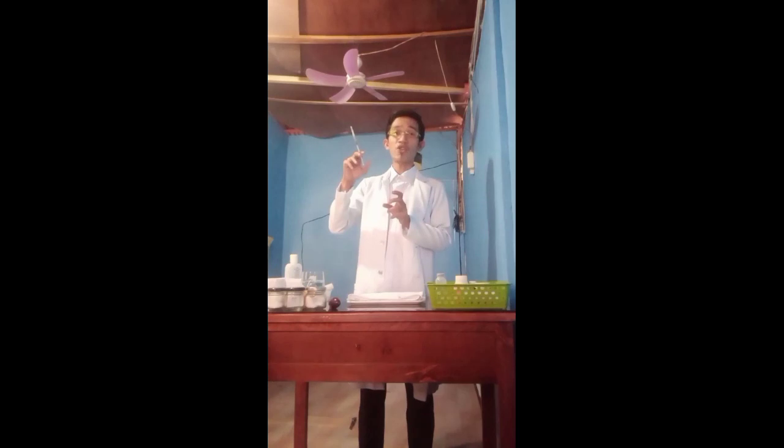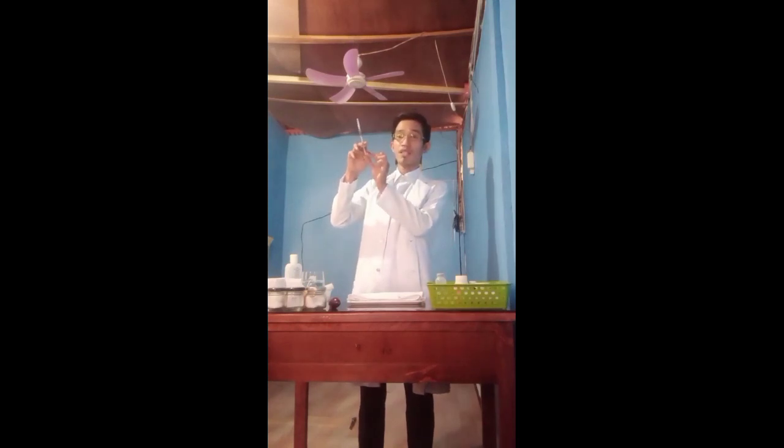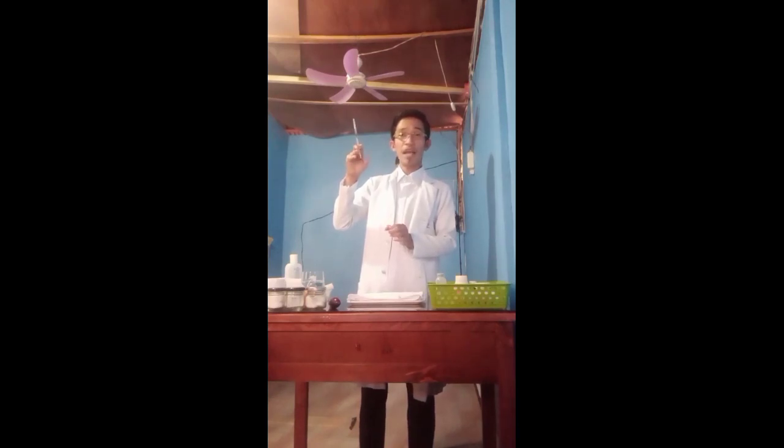If necessary, pull back slightly on the plunger, just simply pull it down slightly to contain the correct amount of solution. As I did earlier, just pull it down to force liquid into the syringe.